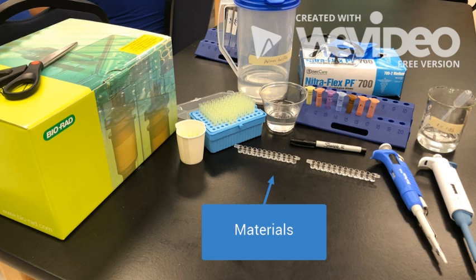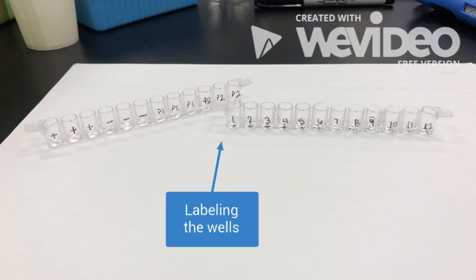The materials we used were 7 colored tubes, 20 to 200 microliter adjustable micropipette, yellow tips, disposable plastic transfer pipettes, 70 to 80 milliliter wash buffer and beaker, paper towels, and gloves. We labeled one well strip 1 through 12 to act as a standard hormone reference, and another with 3 positive, 3 negative, 3 for panda A, and the remaining 3 for panda B.